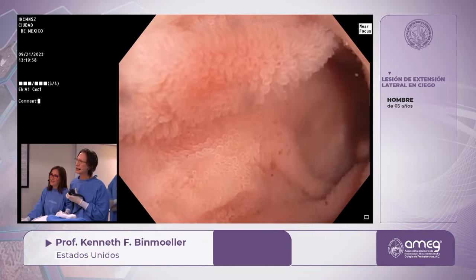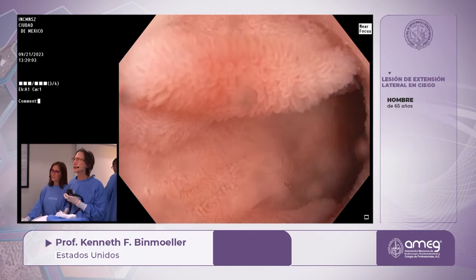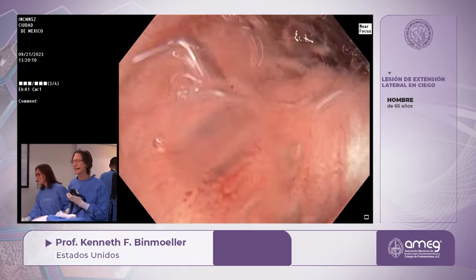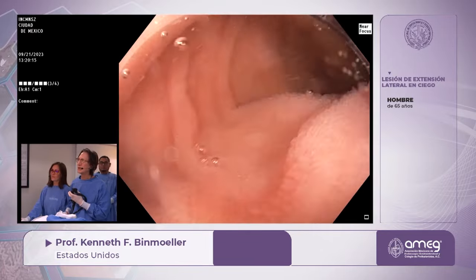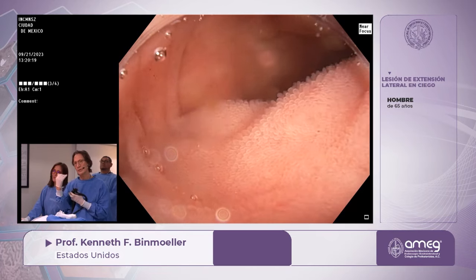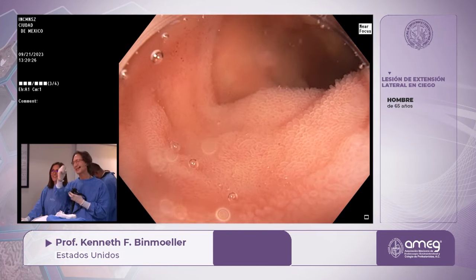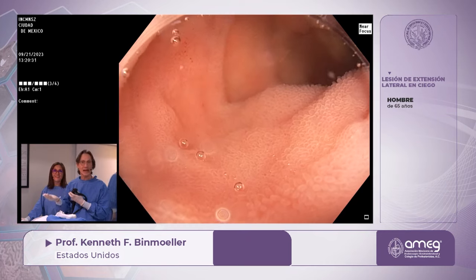And once again, you just circle like this, and you use the water jet to flatten the surface and to get a sense of the compliance of the tissue. So there's many more dimensions of information you're getting underwater. So now I'm coming out, and you see how the IC valve, the opening, it opens towards you. When you give gas, the IC valve thinks you're a lion, a tiger that's attacking it, and it closes. But when you use water, it feels it's in the natural environment.